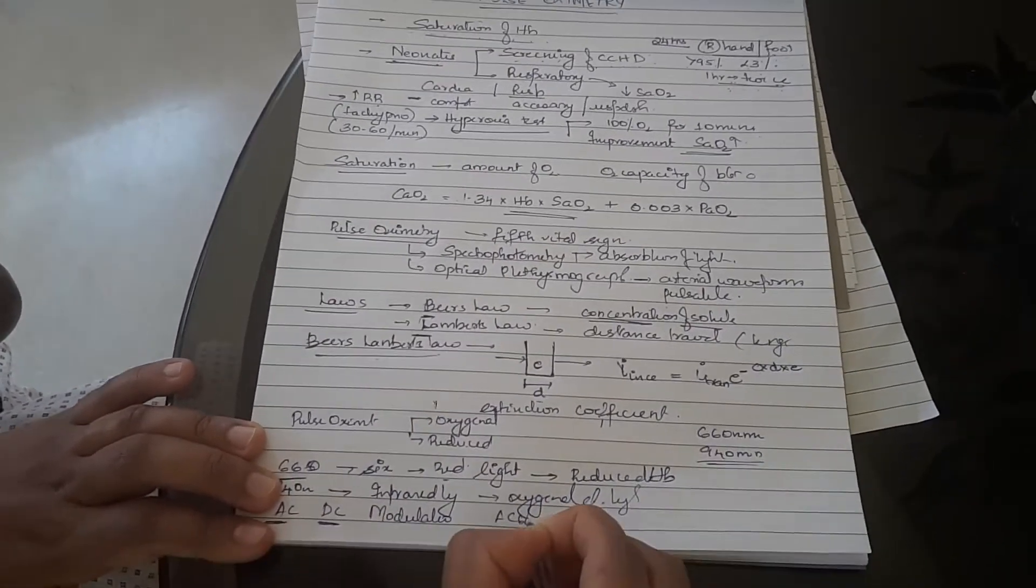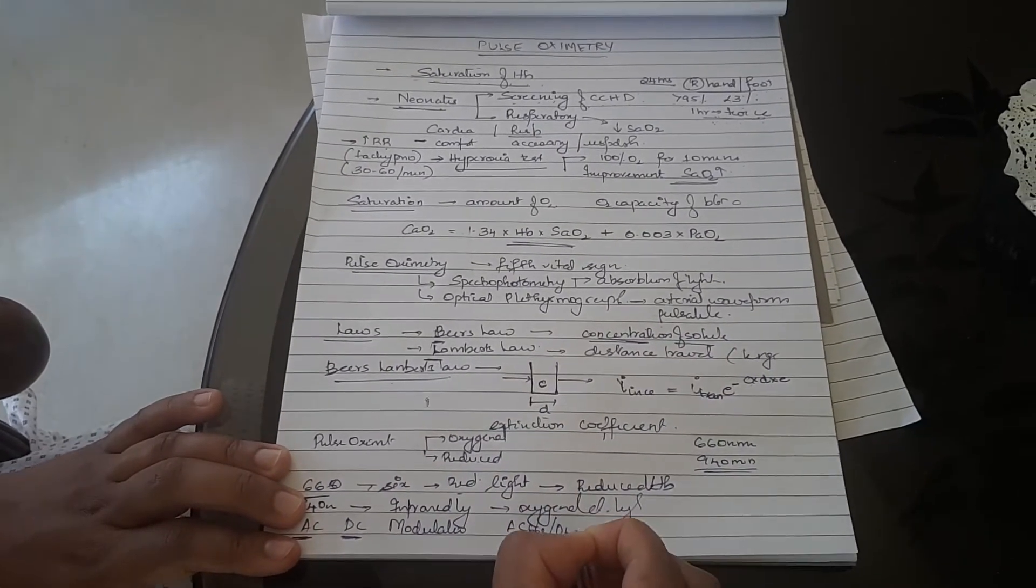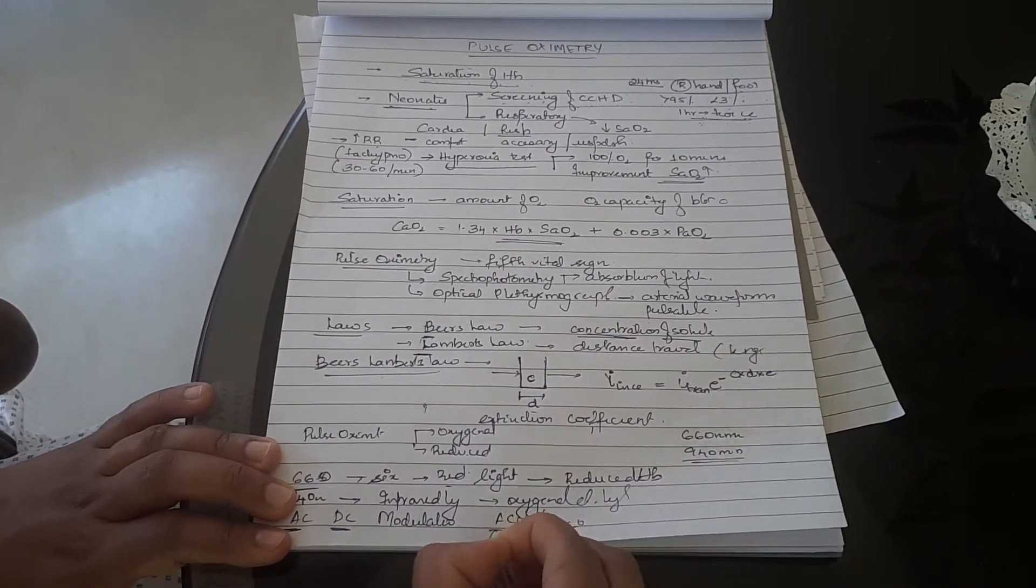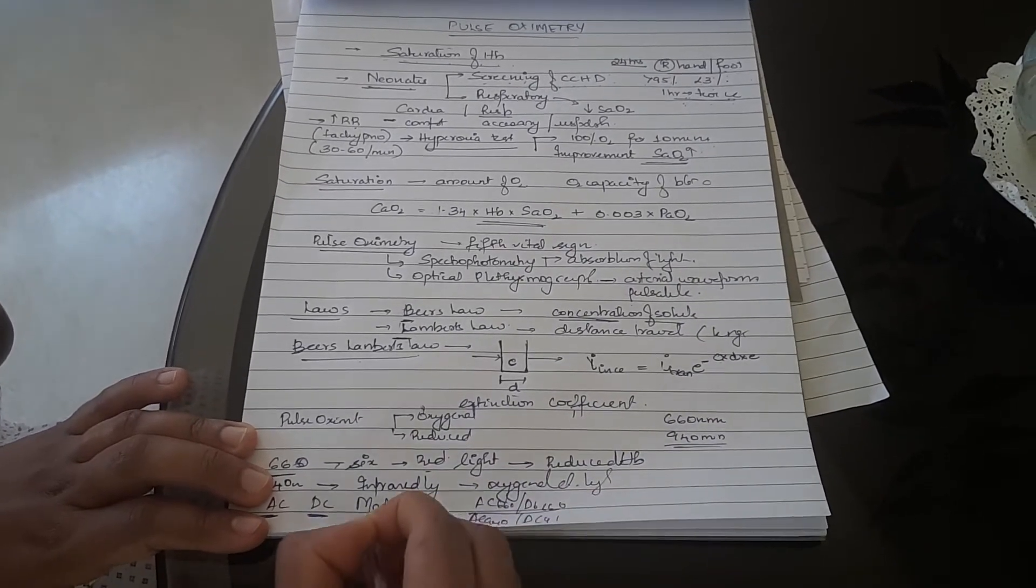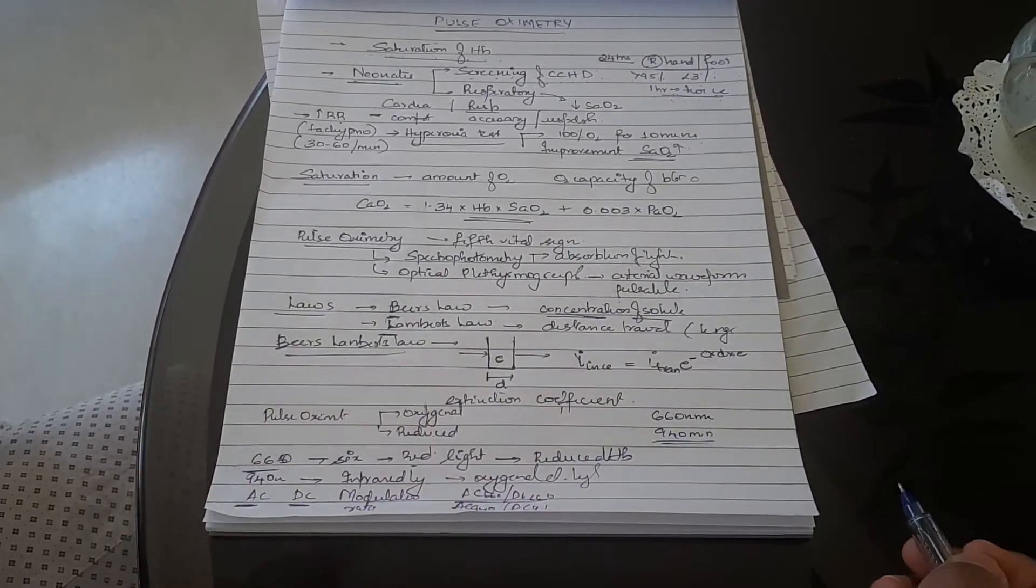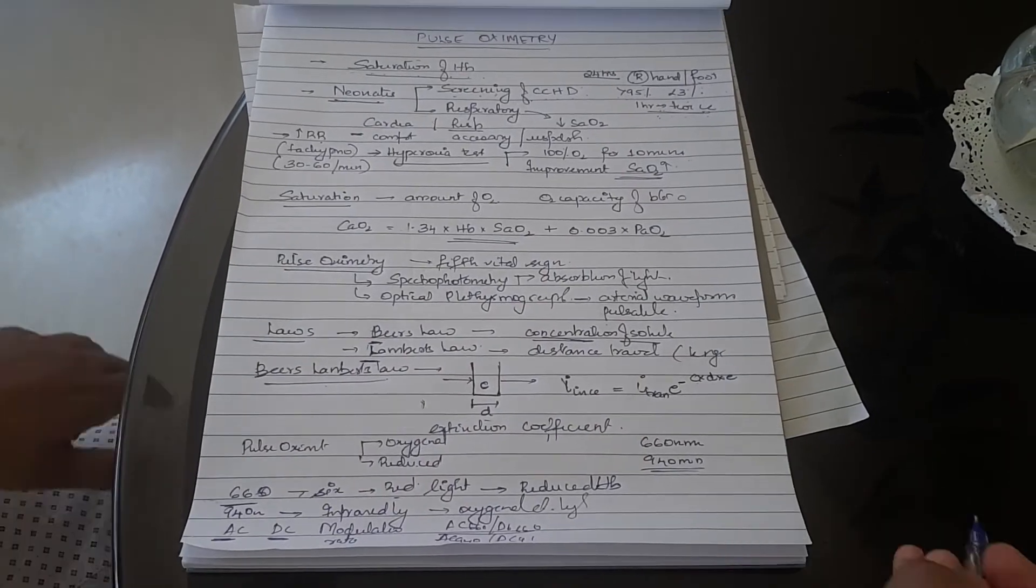That is AC 660 by DC 660. I don't think you need this much for your level because in pediatrics I don't think you need it, but I'm just mentioning. This modulation ratio will then be translated to the amount of saturation.